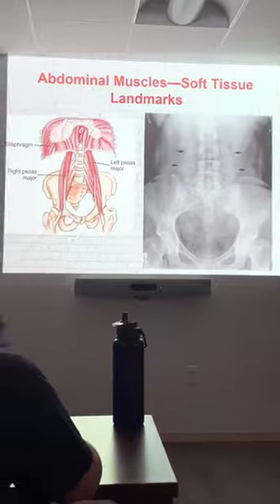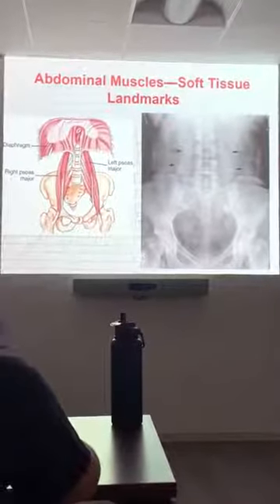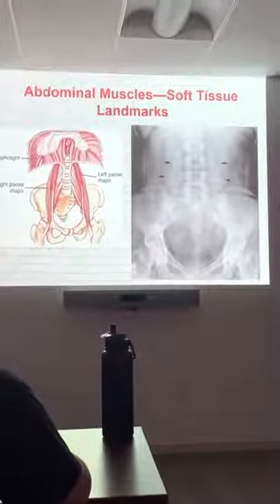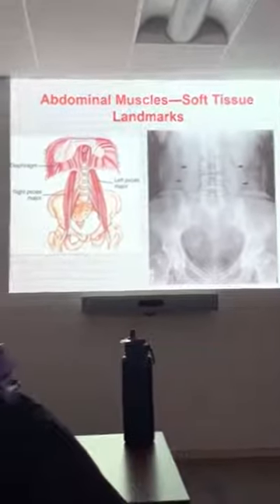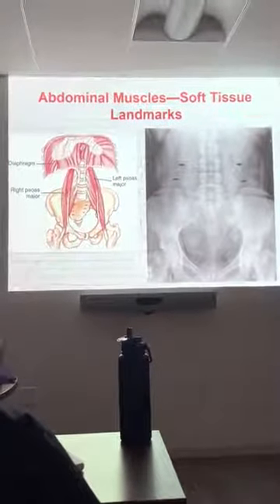We're going to practice that in class if we have time today, or at the beginning of class on Wednesday, how to palpate on each other. Because if you can't palpate the crest properly, you will always center too low or too high. You've got to palpate those crests, and you're going to start doing what I call cup the crests. You've got to cup the crest with your hand and dig in there on the patient's side to find that properly.